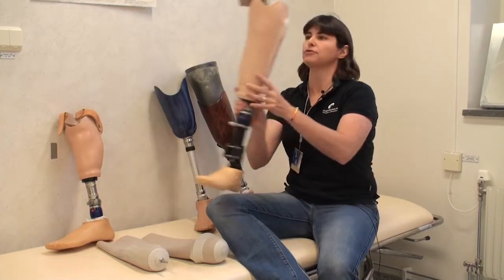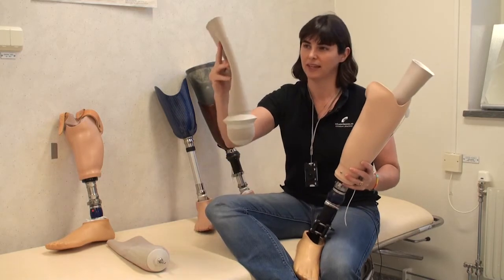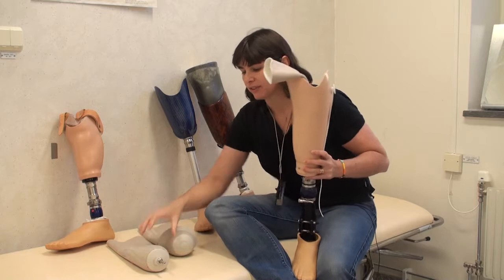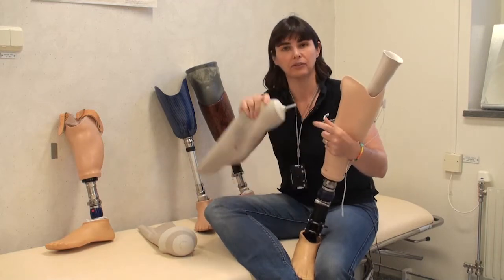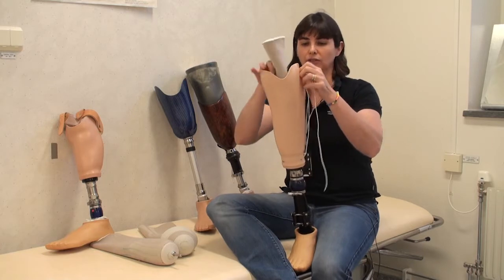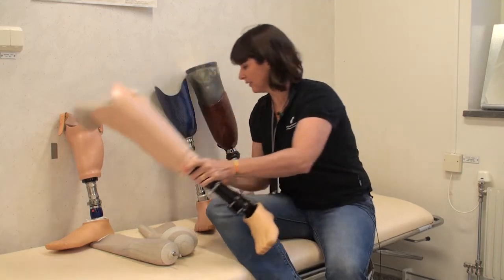In other cases, we have patients wearing a sleeve — I have some examples of sleeves here — that the patient rolls onto their stump. When they have a sleeve on, we can either use a pin suspension that locks into the bottom of the prosthesis, or we could have a string that comes through a hole at the bottom and the patient ties to the prosthesis.